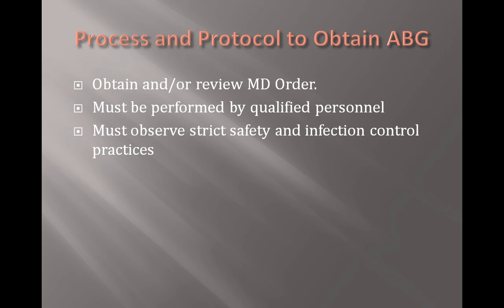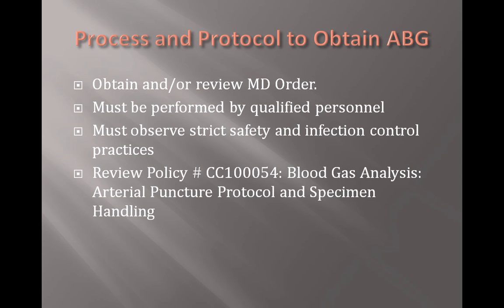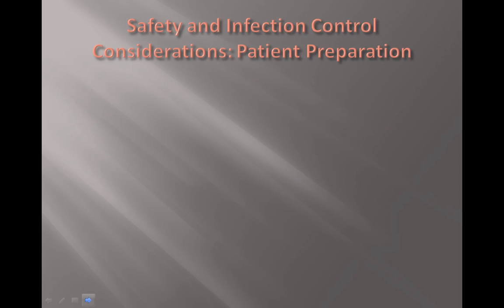Everyone must observe strict safety and infection control standards, and we'll get into these specifics shortly. And finally, everyone performing ABGs is responsible for following Cedars policy governing this procedure. A copy of the policy is part of your course handouts today. Before performing an ABG, let's go through a list of considerations that emphasize safety and infection control to support your patient around this procedure.